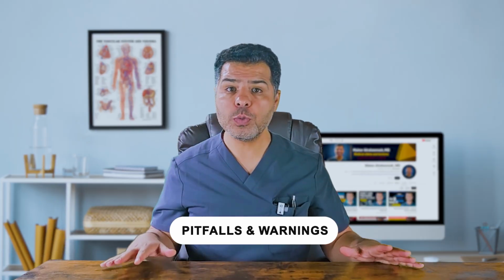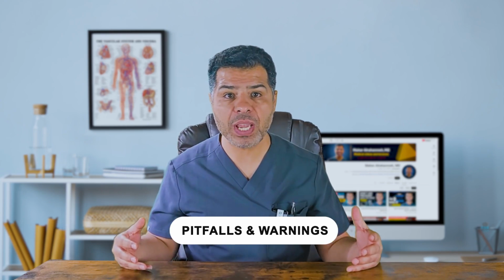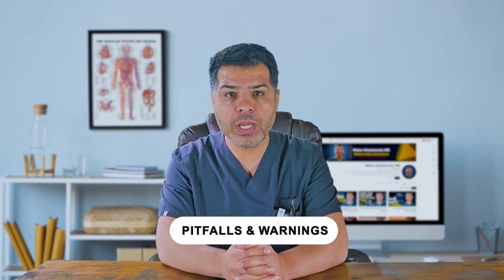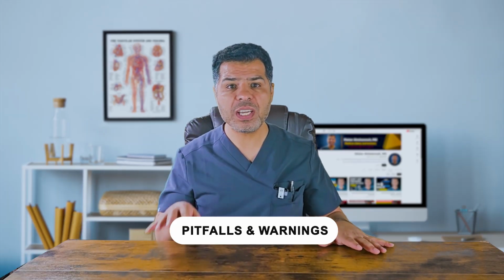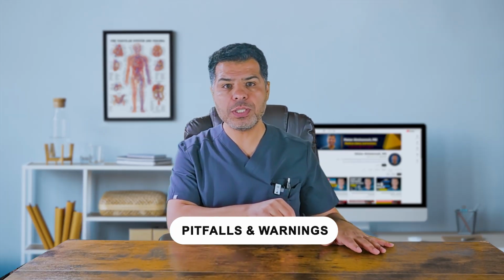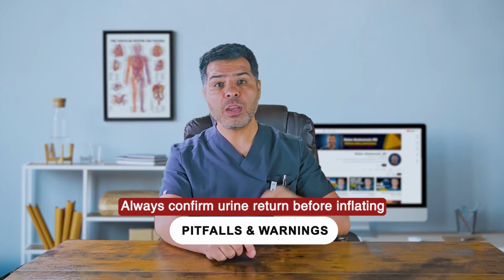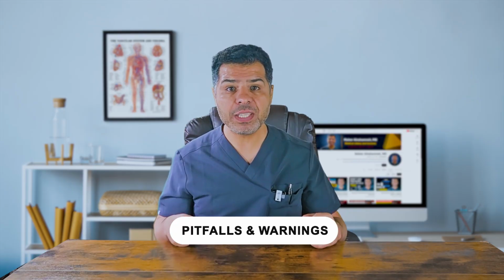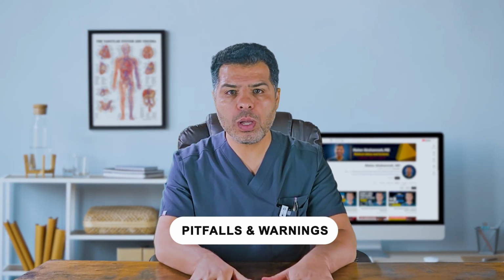Traumatic insertion can cause urethral injury, false passage, or bladder perforation. If insertion was difficult, or you see significant hematuria, or if the patient has severe pain, get urology involved right away. Never force a catheter, please. Balloon inflation in the urethra is a urologic emergency. Always confirm urine return before inflating. If you inflate it prematurely, deflate immediately, advance slightly, and try again. If there is trauma, call urology right away.